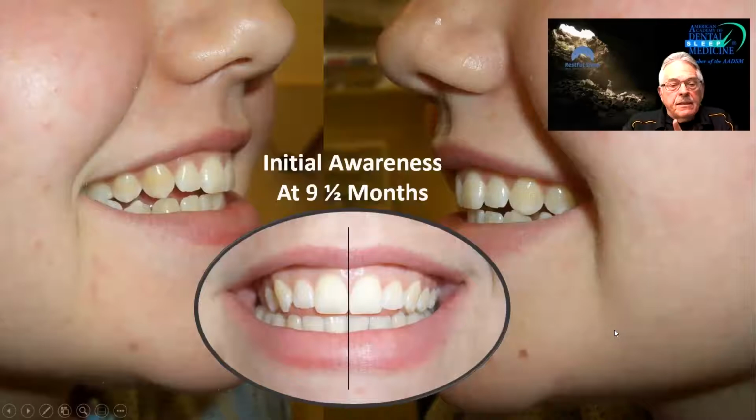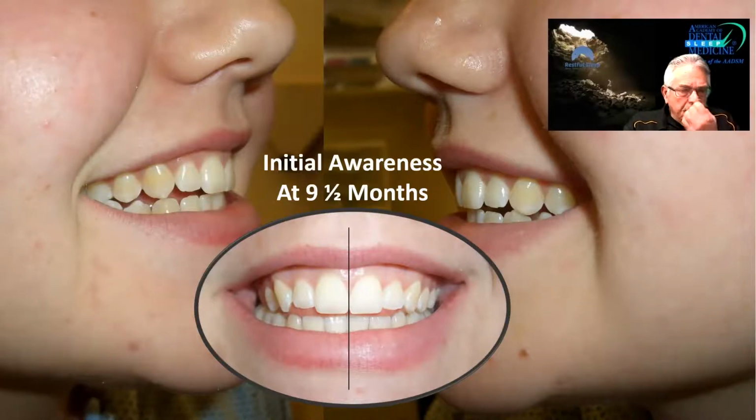So this is an 18-year-old. Again, we're going to get to sleep appliances, but I'm going to give you this background first. This is an 18-year-old that came to me on narcotics. She was on a contract with a pain doc, got 8 or 9 pills a month, and had been on that for quite some time. I forgot how she found me, but we put an NTI appliance in. Within 7 days, I had her off the meds.